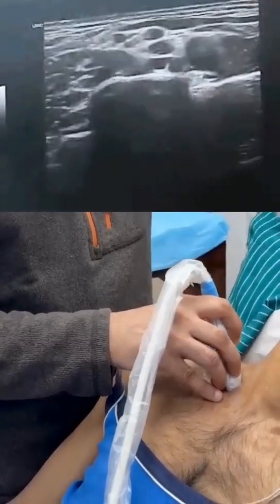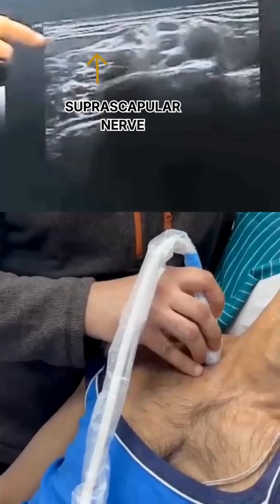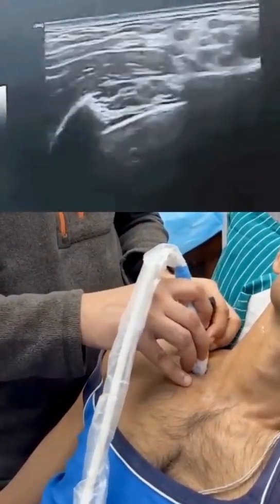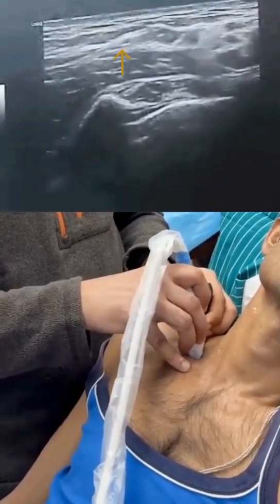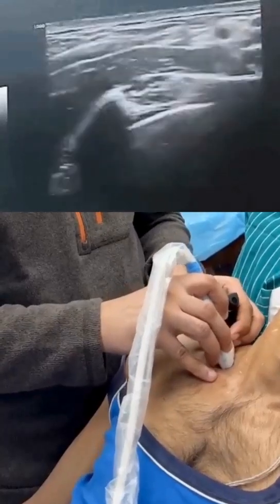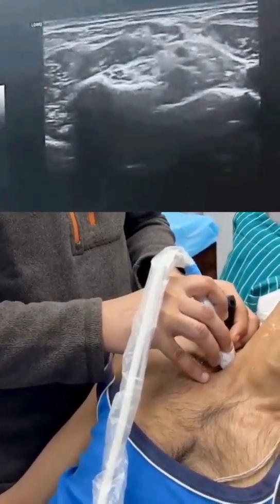Keeping my eye on the lateral border, you can now see the nerve arising. If I follow it further laterally, it will go and lie below the omohyoid muscle, which is now just above the nerve. If I go backwards you can see it joins the upper trunk again.